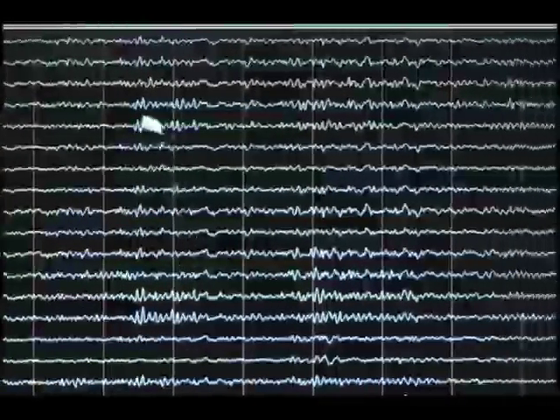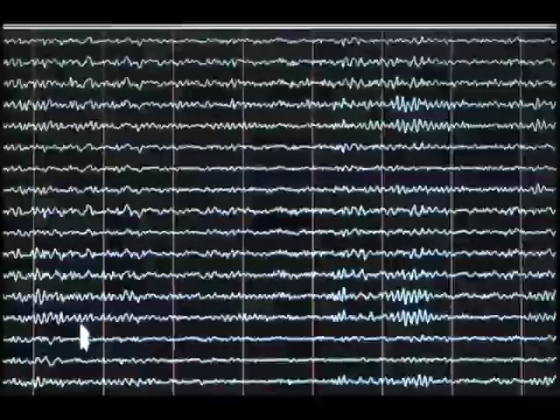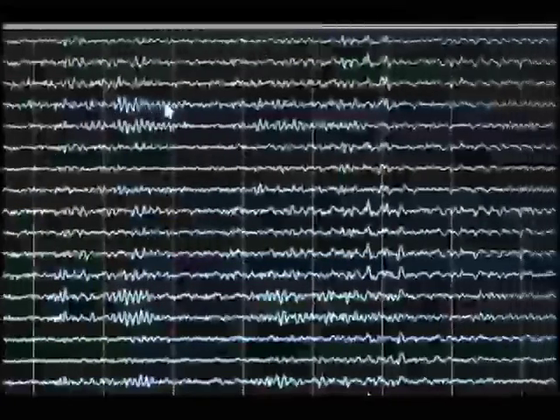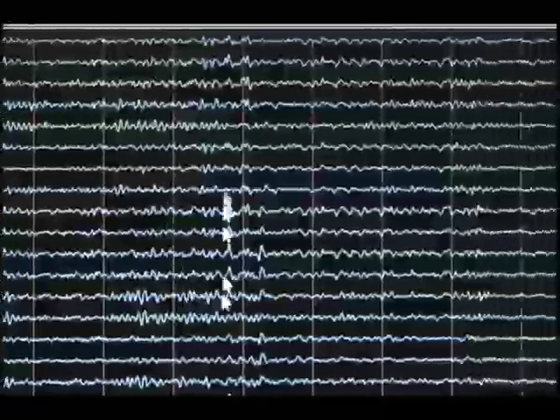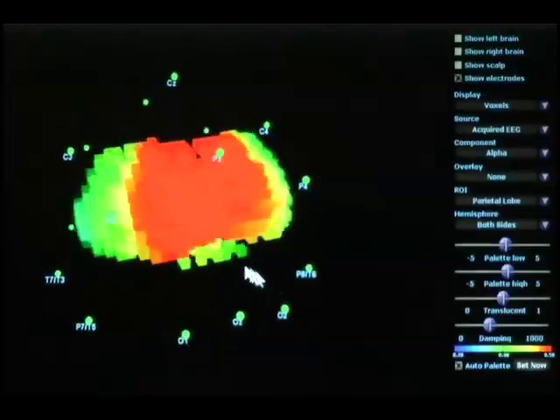When I show the raw EEG, if you were able to see these wave differences visually, you'd see sure enough P4 is just a little bit larger than P3 generally. With the eye you would try and get this out of the waveforms, but with the LORETA display we're able to show that information directly.